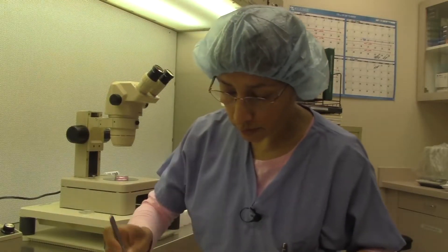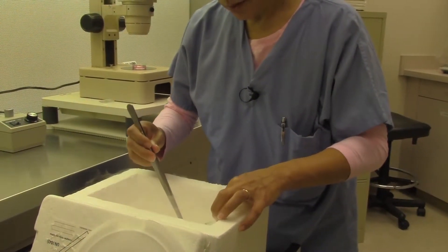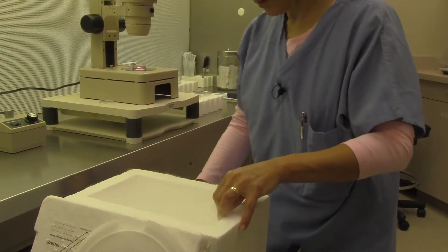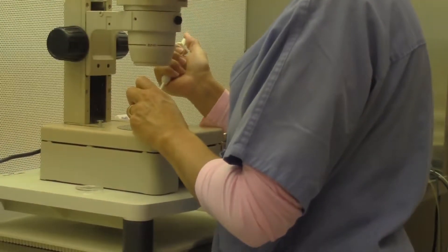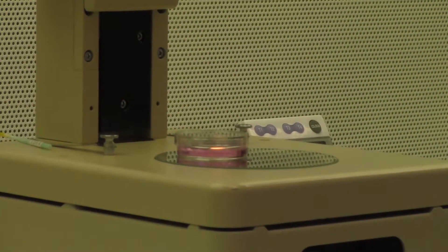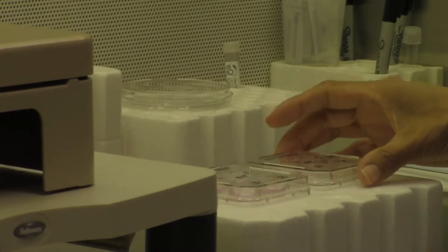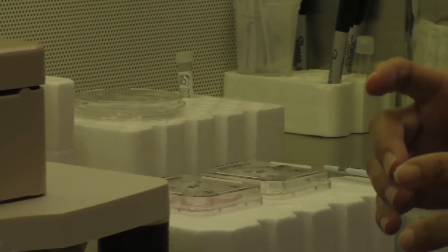The tip of the straw, where the eggs are, is kept below the liquid nitrogen. The first step is to take the outer sleeve off, timing it properly under the first solution, then flush the eggs off the straw and move them to a new position in the dish. We then proceed stepwise through the other solutions — ranging from one minute, two minutes, to three minutes. After the final solution, we move them to an equilibrated culture media dish into the incubator.